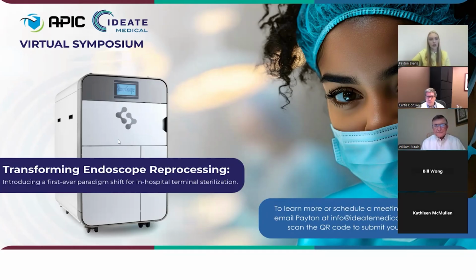Bill, this is a question for you. Bill Wong, what is the maximum height and diameter of the lumens? The maximum diameter, well, we have a minimum diameter of 1 millimeter, and that's good for a length of 3.6 meters.